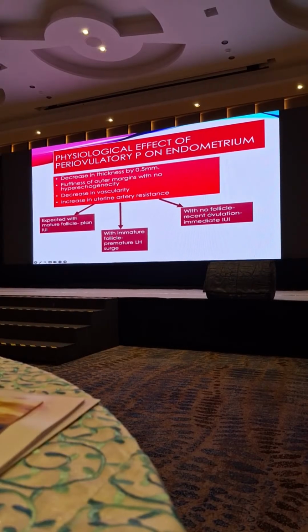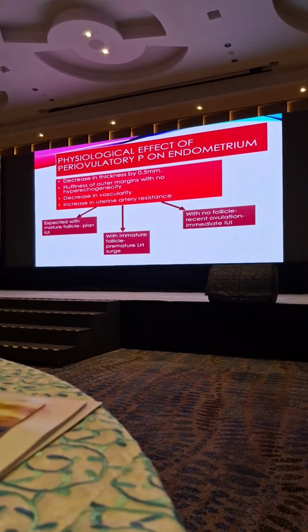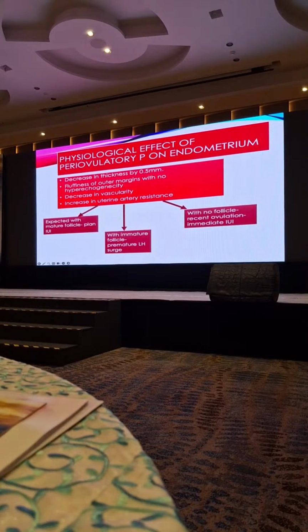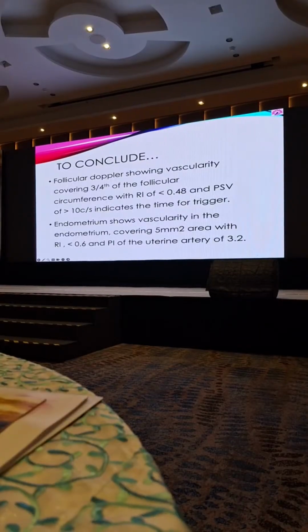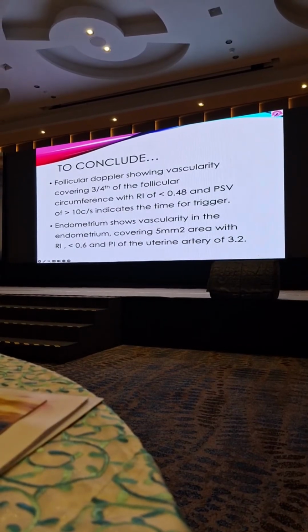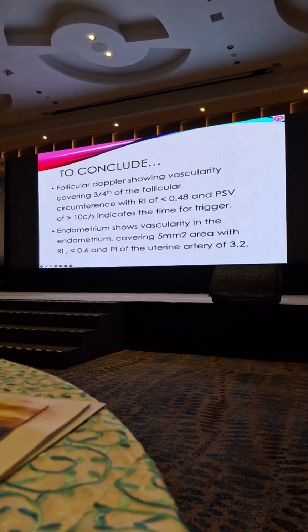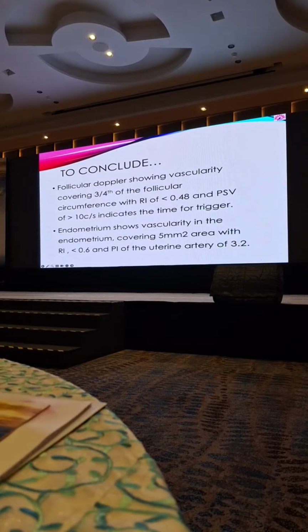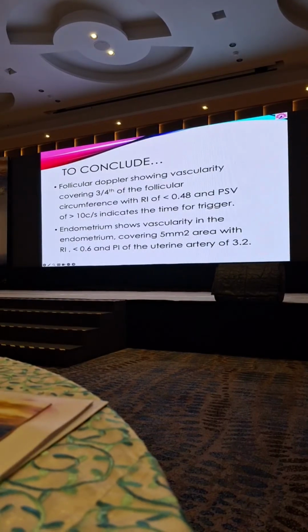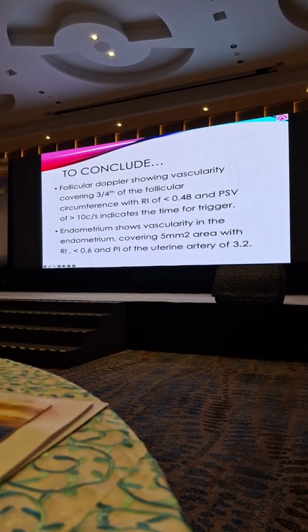Whereas if you see that it's a premature follicle rupture and these effects on the endometrium, it means it's a premature LH surge, and in those cases you might have to prevent the LH surge. Even without doing your pre-trigger progesterone of 1.5 nanogram, you know the effect of progesterone on the endometrium, and you can decide what to do next. So looking at the Dopplers tells you about the functional status. It tells you about the hormonal status instantaneously, and therefore this is the way to go ahead with better results with your IUI as well as your IVF cycles.